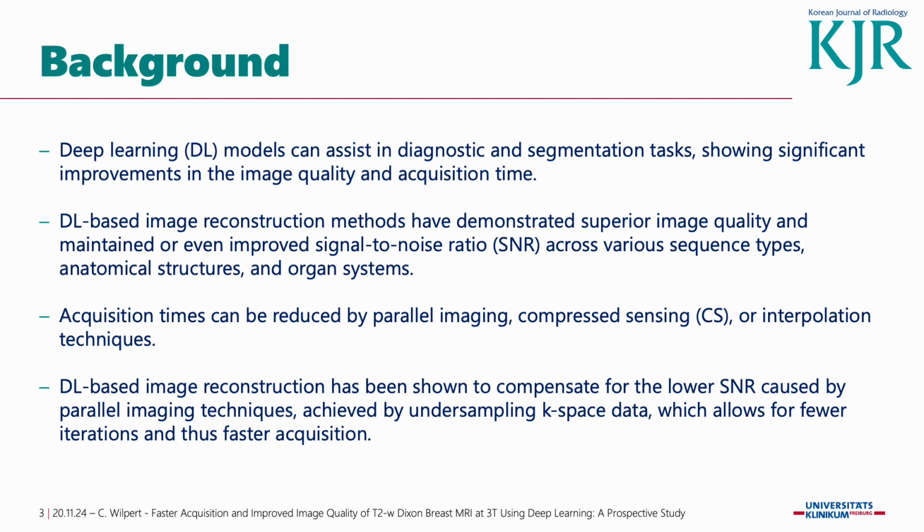Deep learning models can assist in diagnostic and segmentation tasks, showing significant improvements in image quality and acquisition time. Deep learning-based image reconstruction methods have been demonstrated to be superior in image quality and maintained or even improved signal-to-noise ratio across various sequence types, anatomical structures, and organ systems.